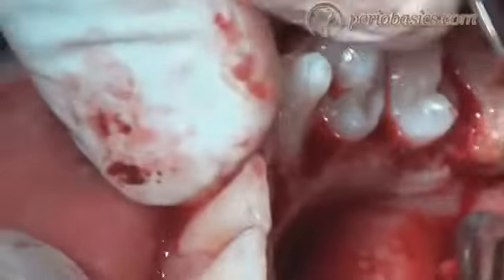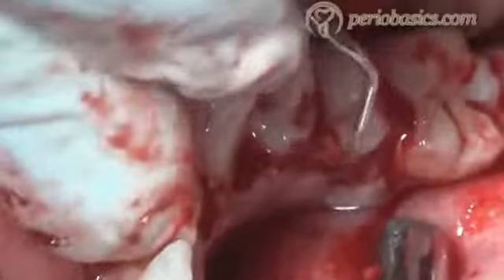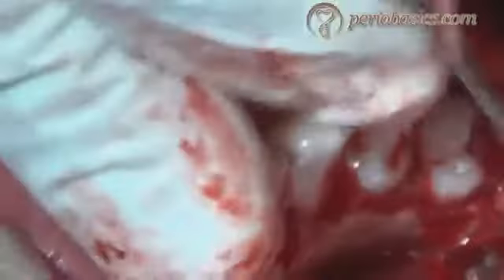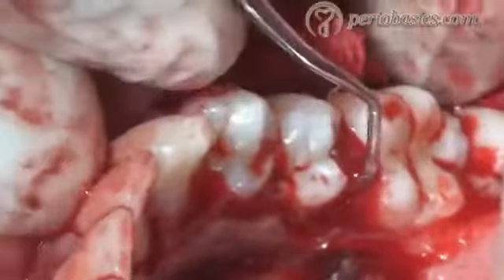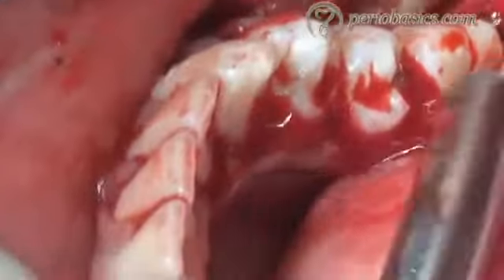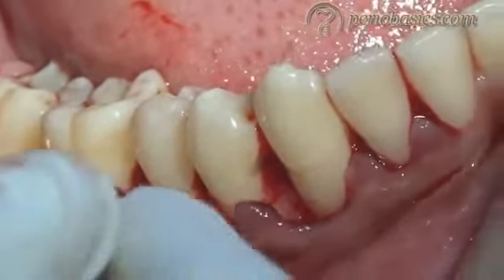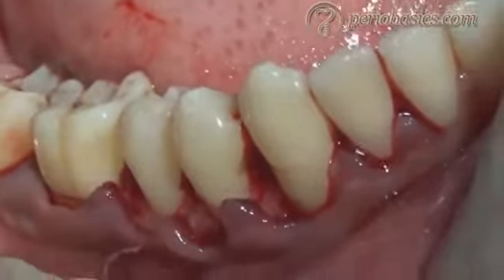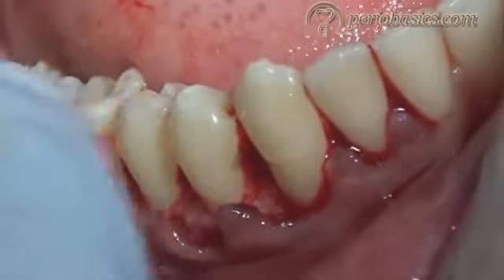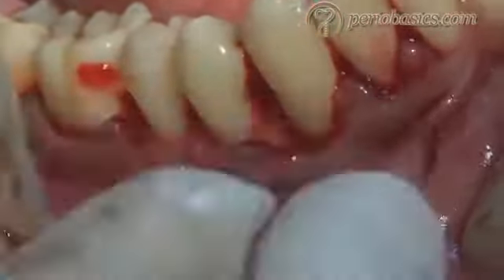From all the interdental areas the granulation tissue is removed. And then when we remove the granulation tissue we have to re-inspect the area for any remaining granulation tissue or tissue tags. So all the tissue tags and the granulation tissue is removed.